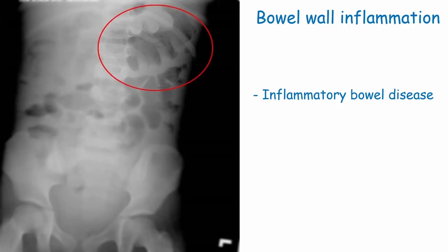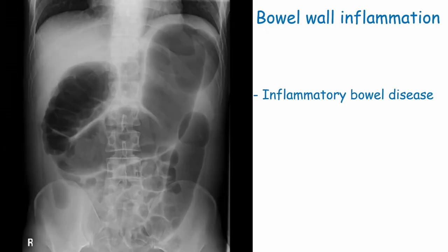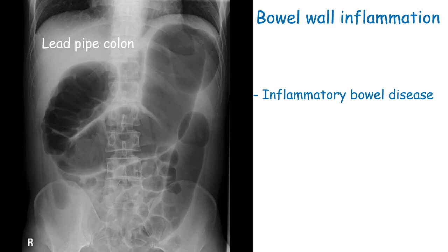Occasionally, bowel wall inflammation can be visible on an abdominal x-ray in the context of inflammatory bowel disease. There are three main x-ray findings. Firstly, thumbprinting - this occurs when the large bowel wall is inflamed and the haustral folds become thickened, giving the appearance of thumbprints. Toxic megacolon is large bowel dilation without any mechanical obstruction; it occurs in ulcerative colitis, can be fatal, and is usually associated with fever and haemodynamic instability. Lead pipe colon sign is a feature of chronic ulcerative colitis where the colon muscle hypertrophies over time, obscuring haustral folds and making the colon appear smooth and featureless.